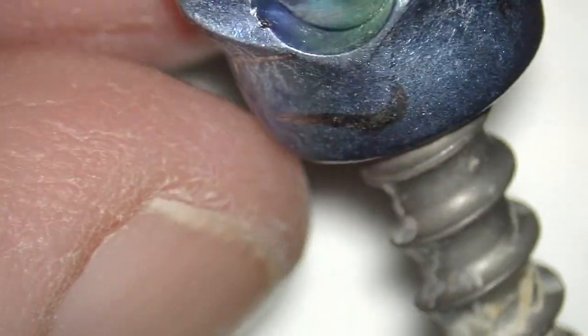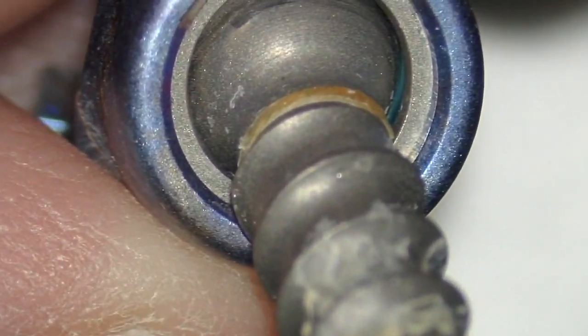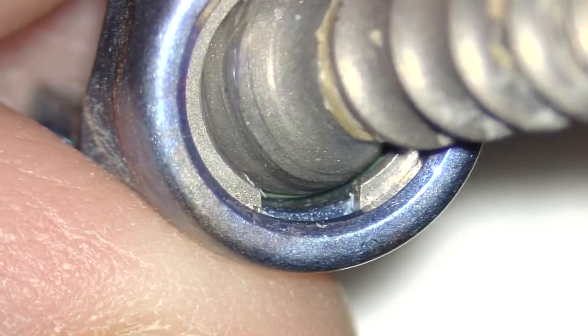So you can see here the angled head is separate from the inner shaft. And you can see there's a small washer there for the angled head. And that's the shaft portion of the screw, which is separate.